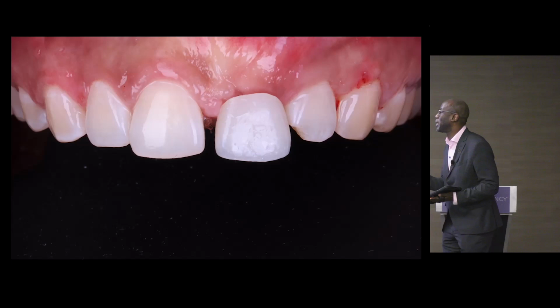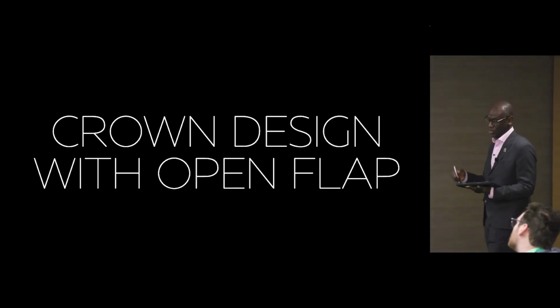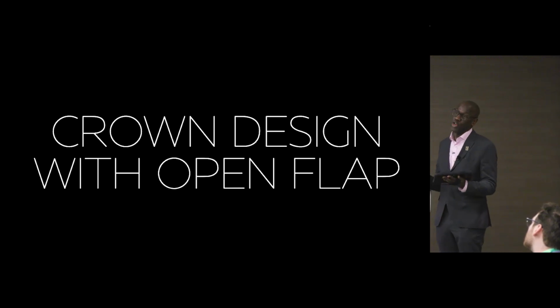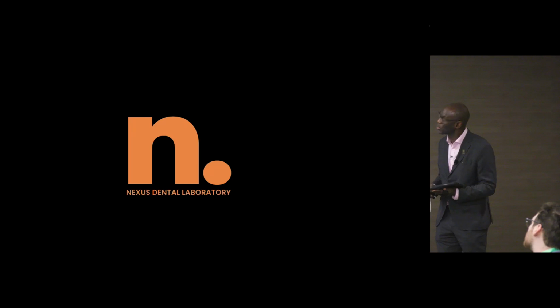At the time the patient is healing, Steve is busy in the lab, and this is the point where he's able to do his crown design. But he has an open flap, so he's just got to copy the other tooth and give me the ideal contours. Steve, it's over to you now.